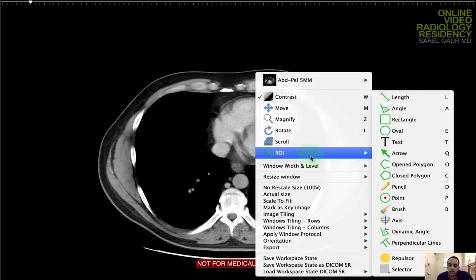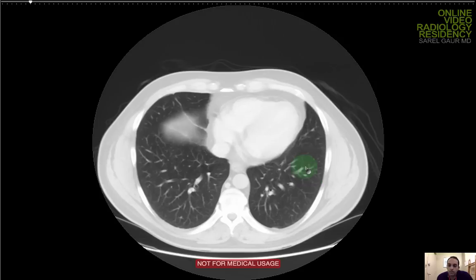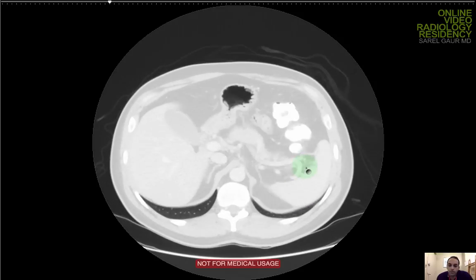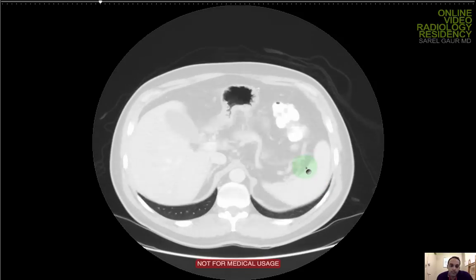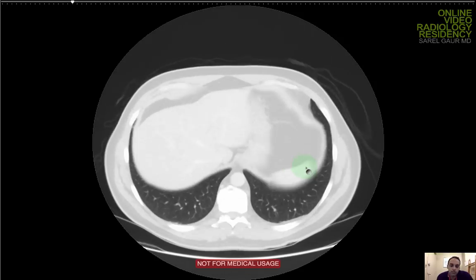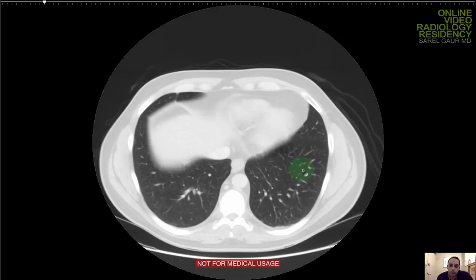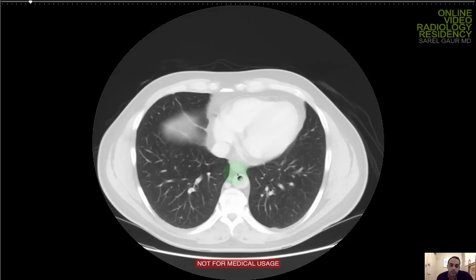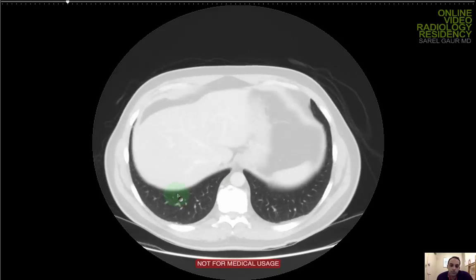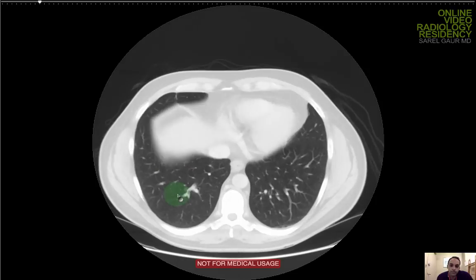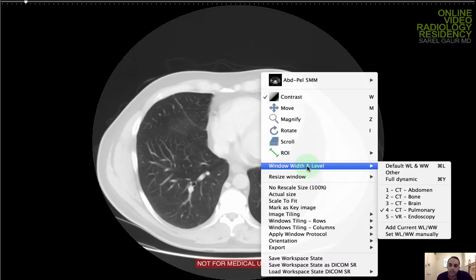I'm going to start with the lungs. I'm looking at lung windows, looking at each lung, basically looking for effusions or consolidations, pneumonia, congestion, any findings I can pick up — small nodules. I'm not seeing anything. The lungs are clear.